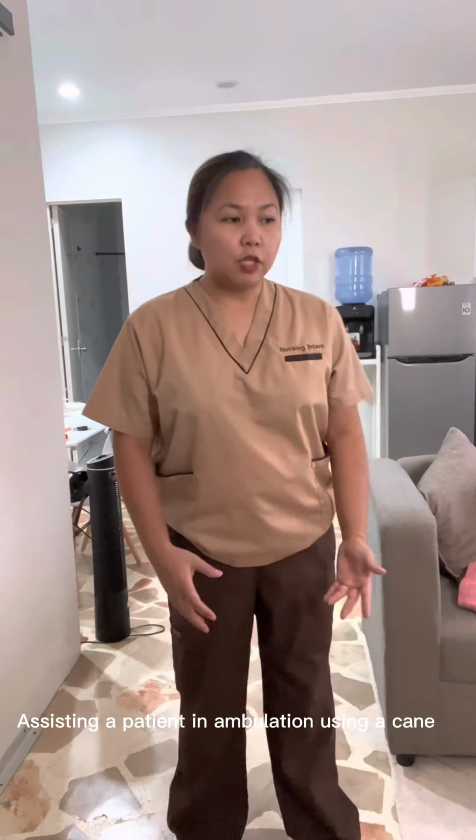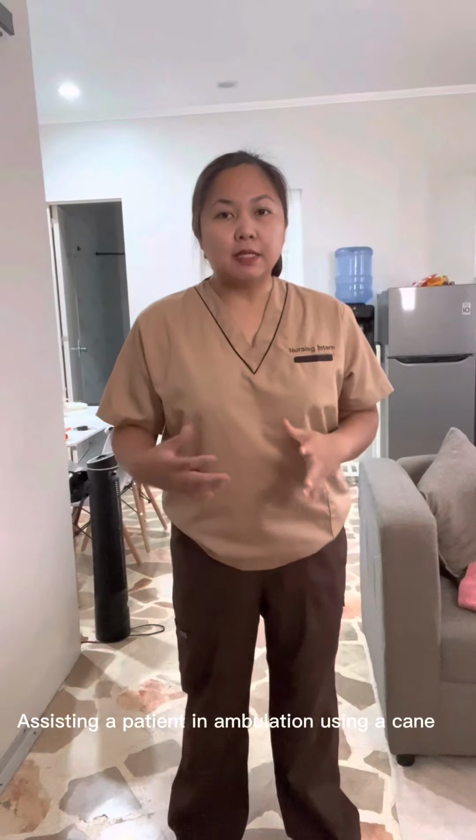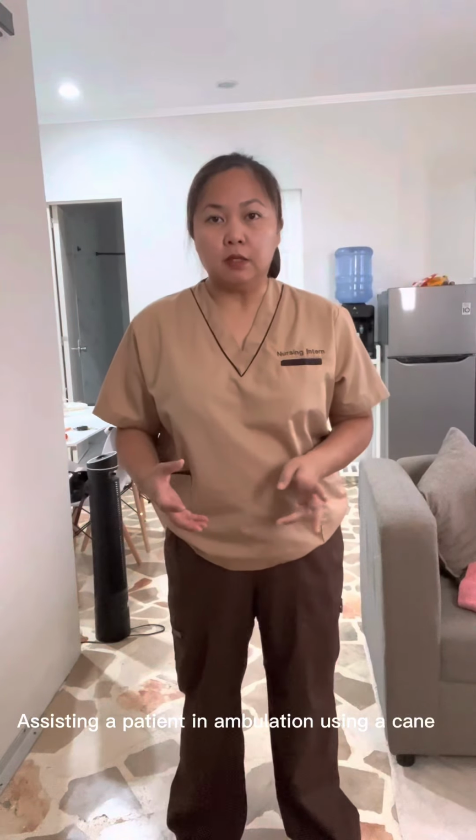This is Jara, and today I'll be demonstrating how you're going to be assisting a patient in ambulation using a cane.